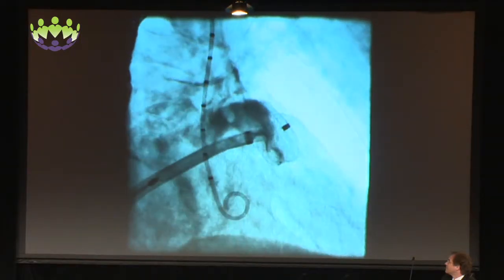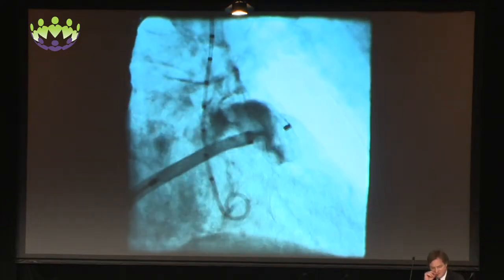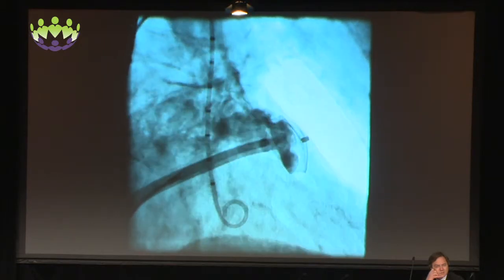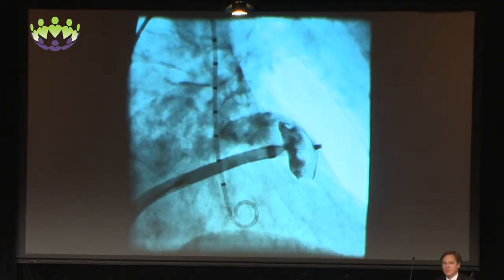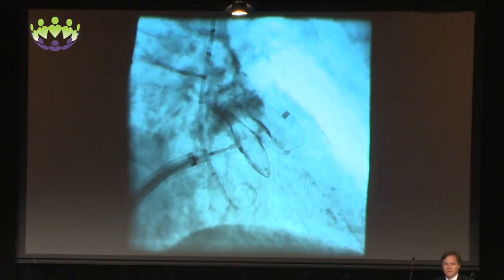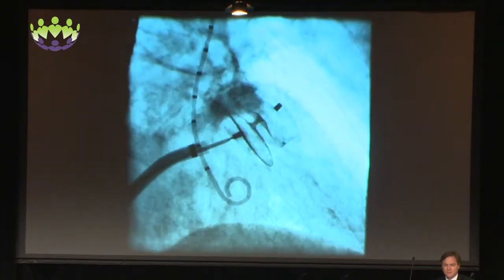At this point, we can see very clearly that the ostium is here and the PV ridge is just sitting here now, not allowing filling distally. The other interesting thing is to watch how it settles, and the amount of compression on the device reduces as it sits in position. And then we can pull out, watch it shift back a little bit with good occlusion, with the PV ridge between the lobe and the disc.